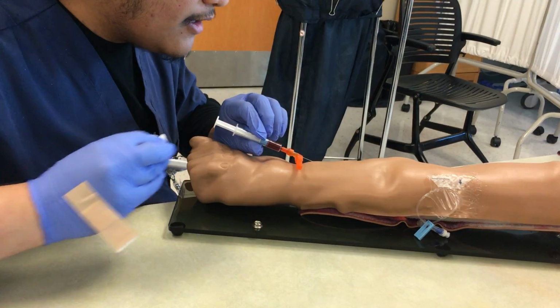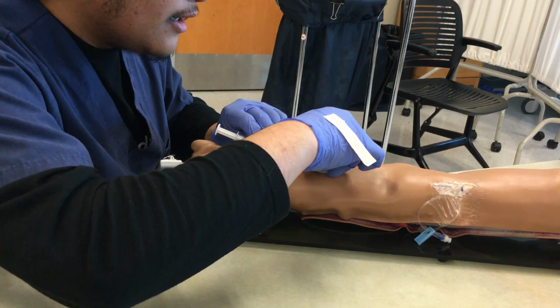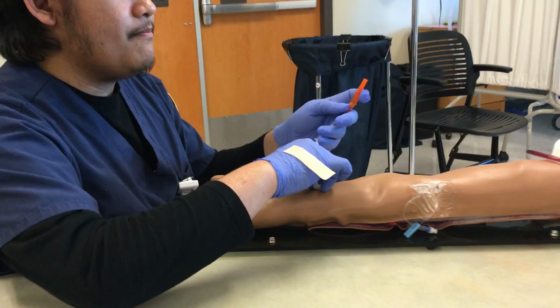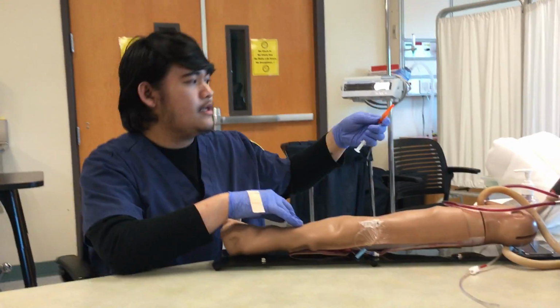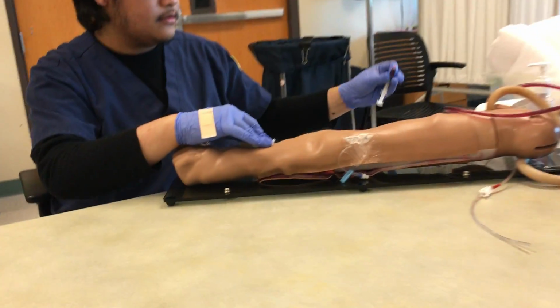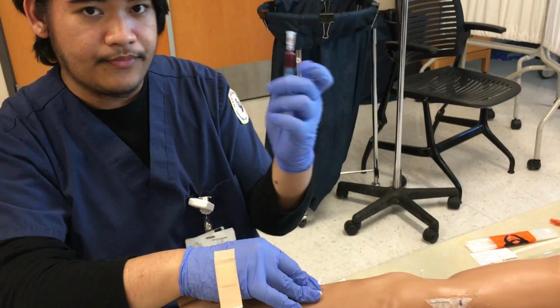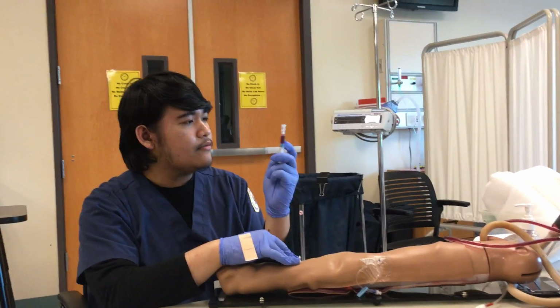Once it's filled, you could place the gauze in here and apply pressure. Cap, make sure that you don't poke anybody. Take the sharp out, place the cap. Make sure that you tap it once or twice.